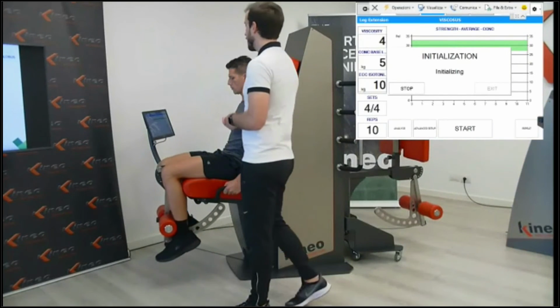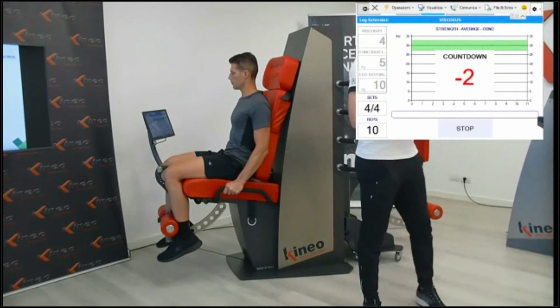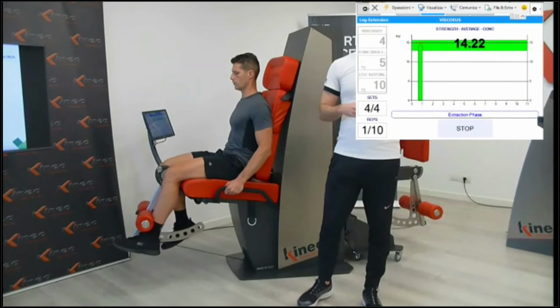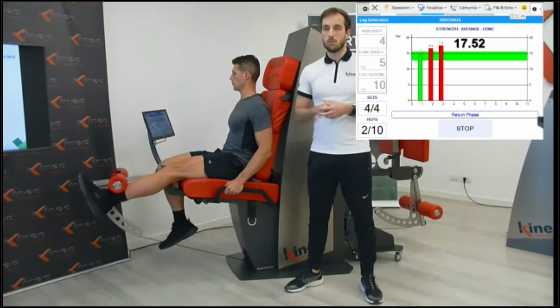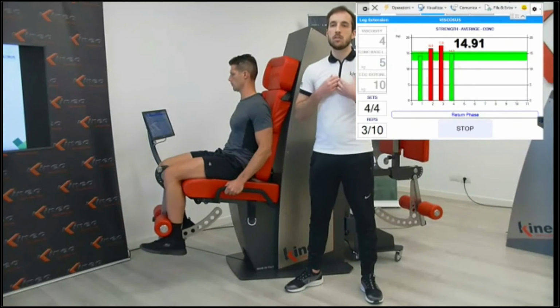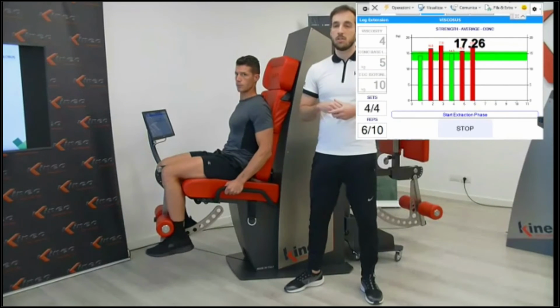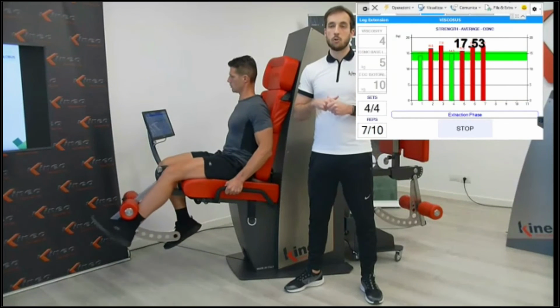But still, for the next one, go a little slower. Now go a little slower in the next few repetitions. Clicking start. And now with the same type of viscosity, we can do the same slow execution as before, 14 kilograms, 16 kilograms, as before it was 22. So in this way, again, we can manage the load by his execution. I'm not giving him a fixed load that he may or may not tolerate, because maybe there was some tissue healing going on and some pain still during his movement.